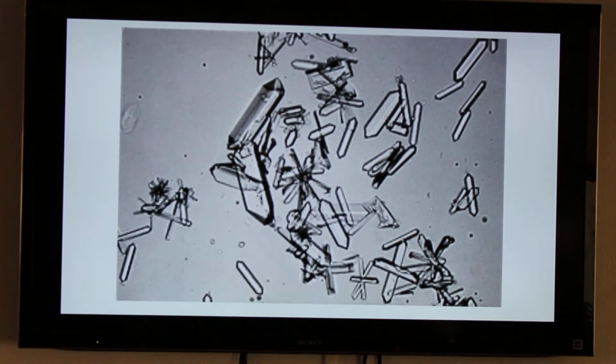Number 2 is a calcium oxalate monohydrate. This comes from antifreeze toxicity or ethylene glycol. Usually by the time you see these crystals in the urine, it's a poor prognosis. You can also see these in a dumbbell shape as well. There aren't any on this picture, but generally you're looking for the fence post shape, which is this one. And also knowing that, yes, this is a calcium oxalate, but important to know it's a monohydrate.